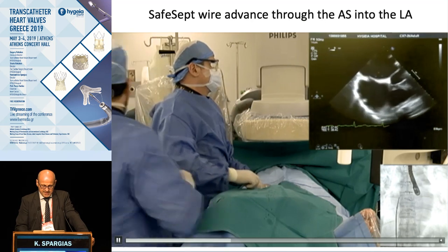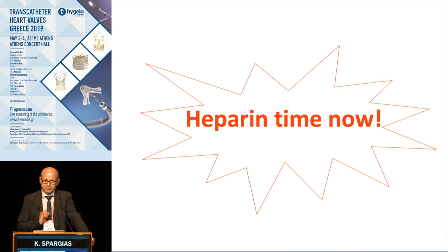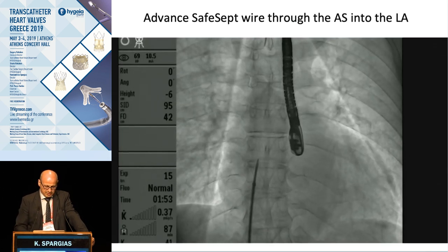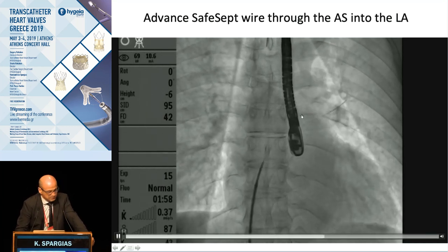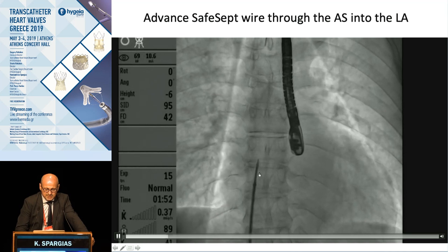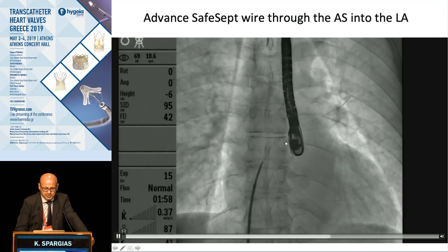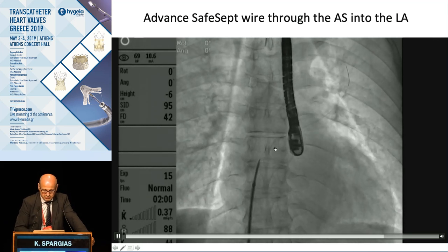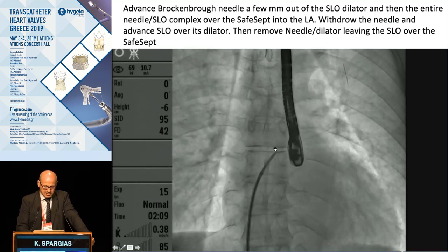After checking all this very carefully, take your time — mistakes at this part of the procedure are costly. When you cross, you advance the SafeSept, and this is the moment to give heparin. Do not forget this very important step: when you cross the septum and are into the left atrium, give the heparin. Here is the SafeSept going up. Then when you have the SafeSept positioned, you advance the Brockenbrough needle and enter.